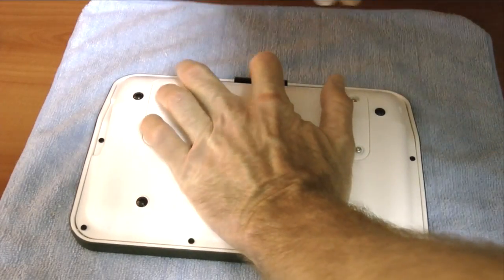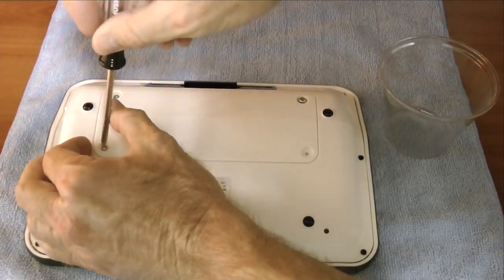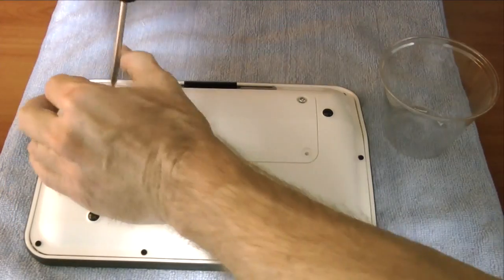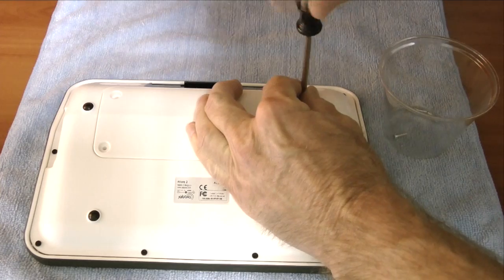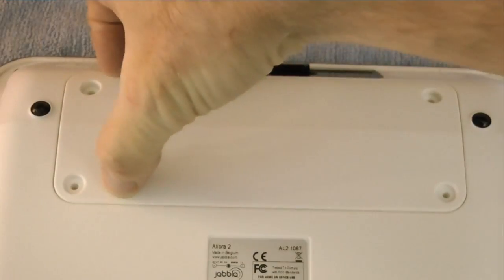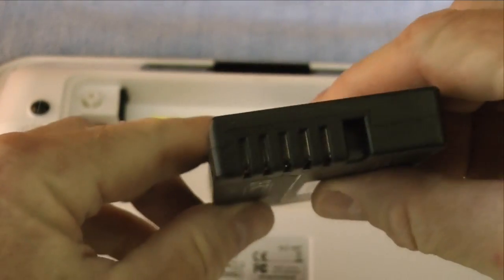Remove the ADI wireless module if installed. Using the Torx number 10 screwdriver, remove the 4 Torx number 10 battery cover screws and put them in the container for safekeeping. Lift off the battery cover and remove the internal battery by pulling on the ribbon cable on the left-hand side of the battery. This is the connector side of the internal battery.